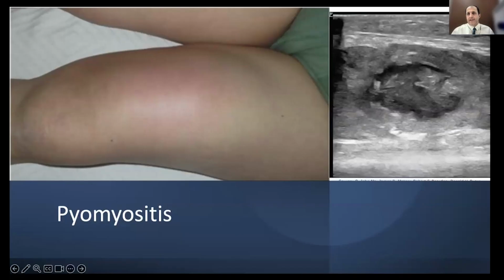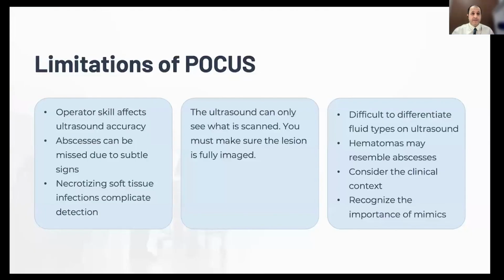It is the dermis and hypodermis, very tiny and echogenic. Here it is subcutaneous, here is the fascia, and here is the muscle. So where is the abscess? Inside the muscles, the muscle's belly. So it is pyomyositis. The management of this case is completely different from the case with simple cellulitis or simple abscesses.